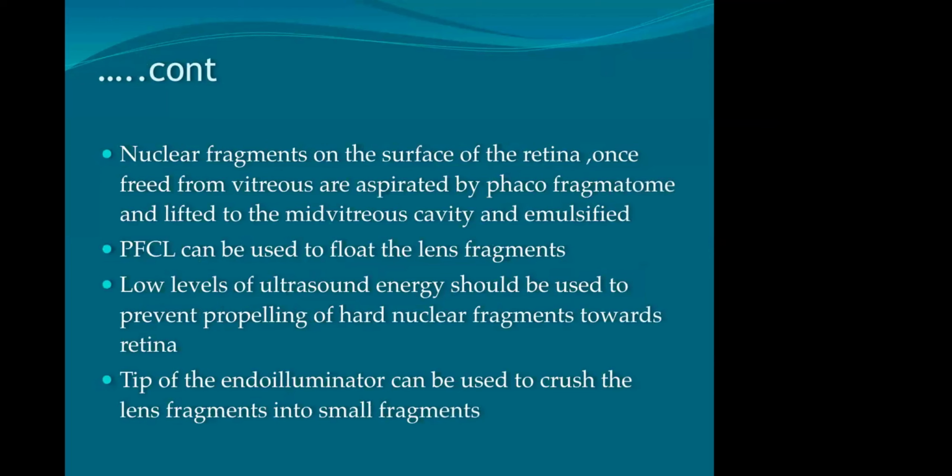Now, if you find that some of the lens fragments are seated on the disc or macula, you can use PFCL, perfluorodecalin, the heavy liquid, and float the lens fragment above the disc or the macula before applying the lens fragmatome, because it can damage the macula or disc when you try to go too close to the macula. So always use some PFCL to elevate the lens fragment above the retina.